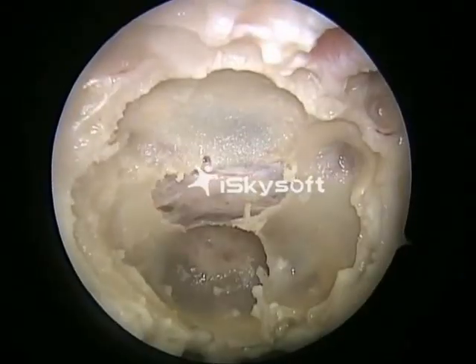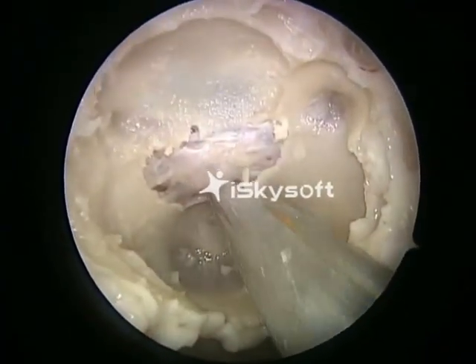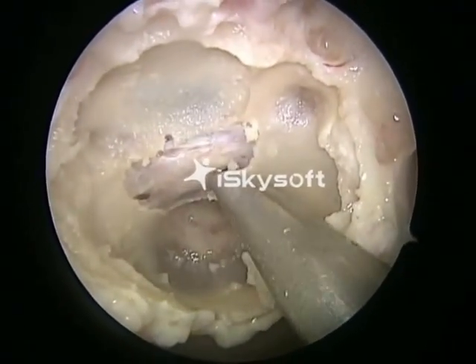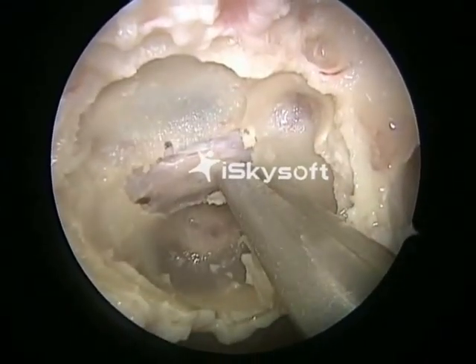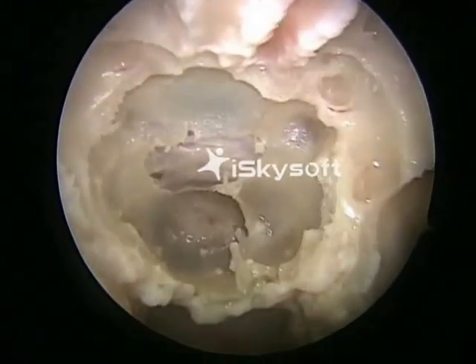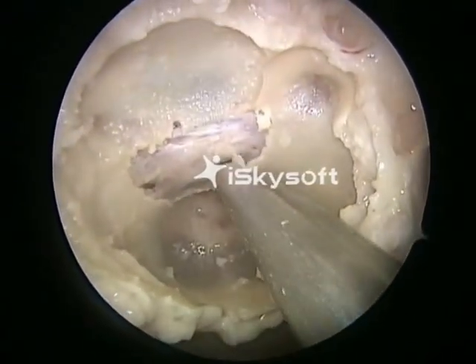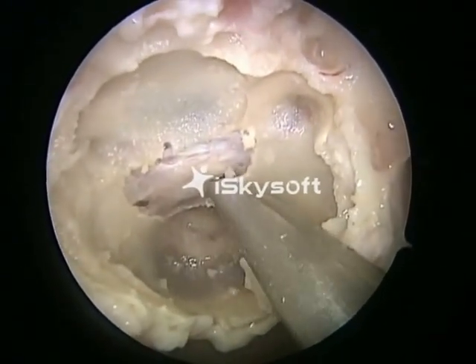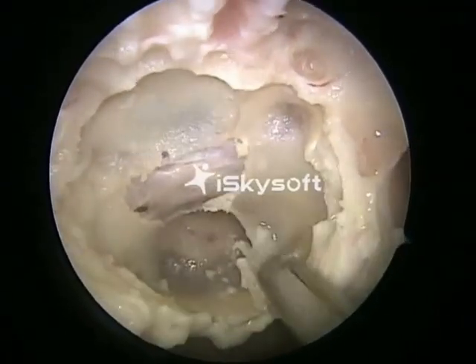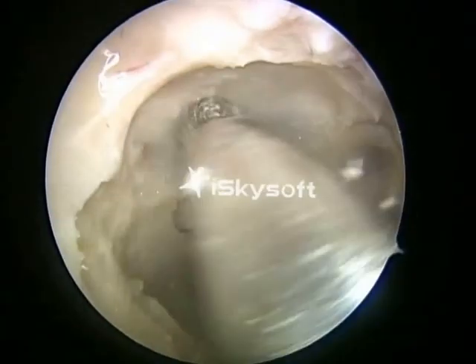Now we can see that the bone is being exposed till the cavernous sinus laterally. You can see that the punch forceps is being used as an elevator. And this I learned from Professor Daniel Prevedello.